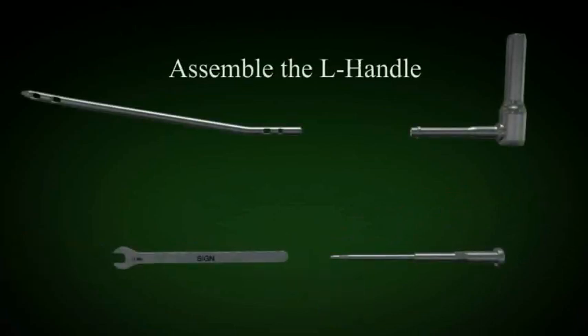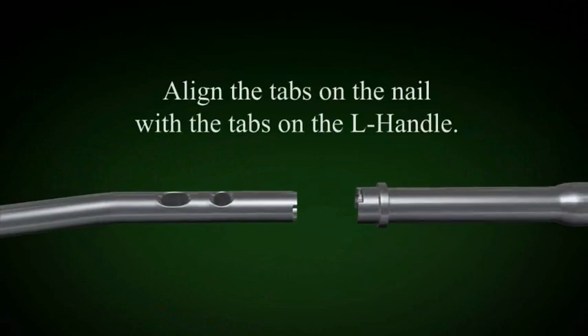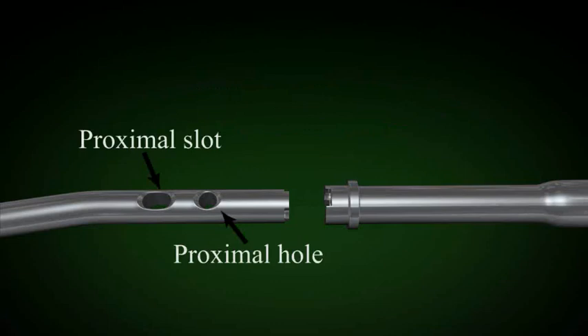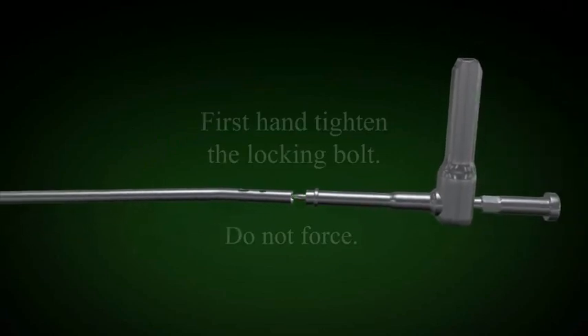The nail is then set up using the locking bolt and the L handle. Note where the curve of the nail will be when you set up the locking bolt and L handle. In the antegrade approach, set up the locking bolt and L handle and nail so that the proximal bend is directed anteriorly.